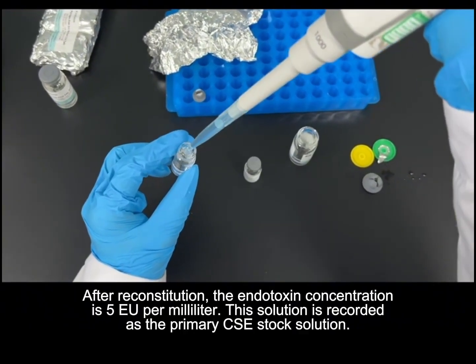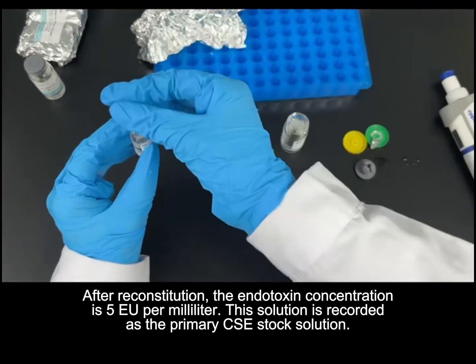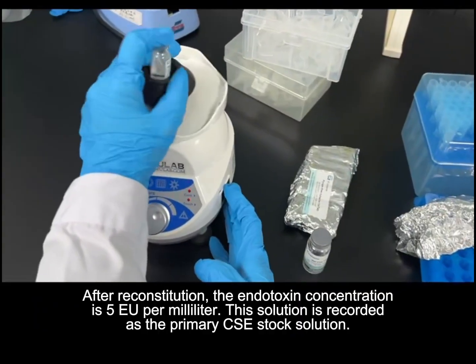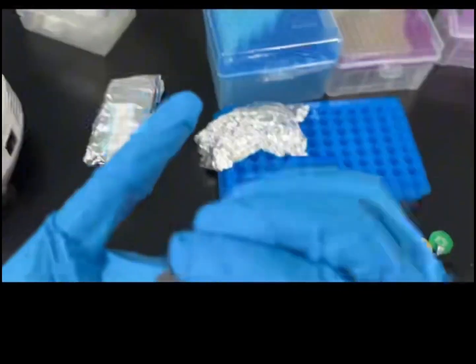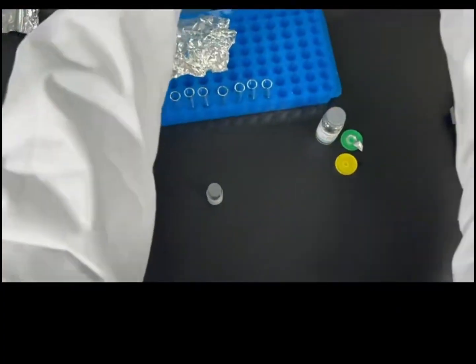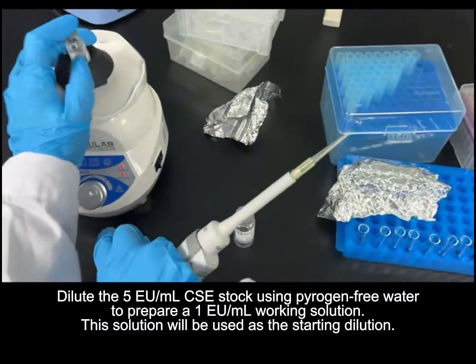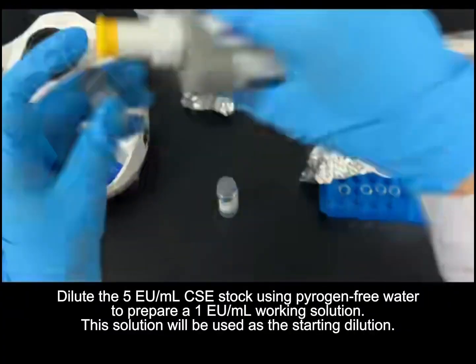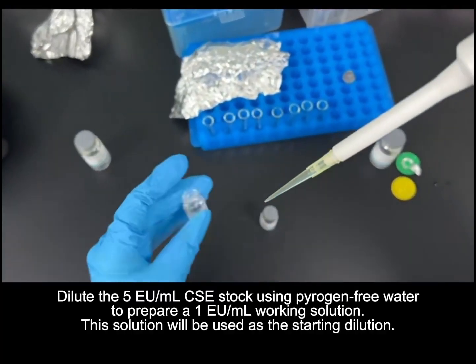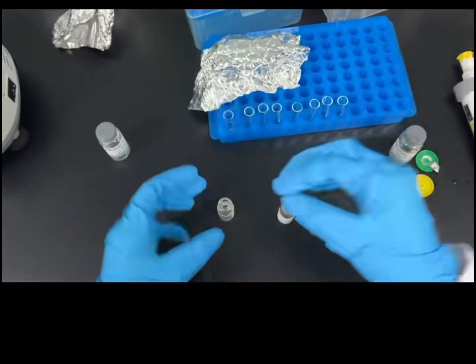After reconstitution, the endotoxin concentration is 5 EU per milliliter. This solution is recorded as the primary CSE stock solution. Dilute the 5 EU/ml CSE stock using pyrogen-free water to prepare a 1 EU/ml working solution. This solution will be used as the starting dilution.